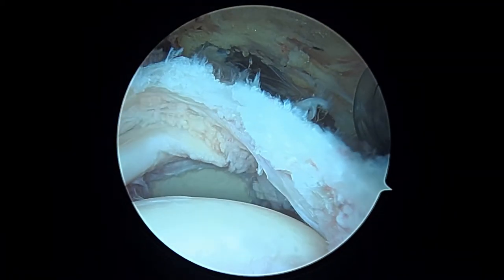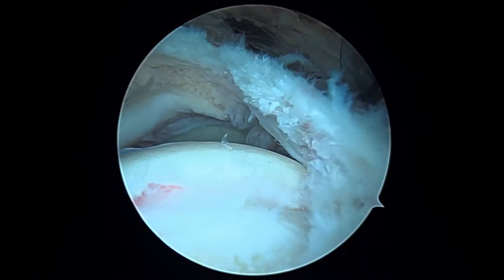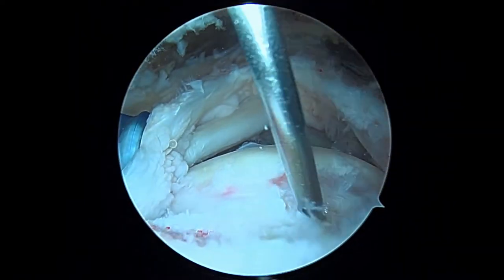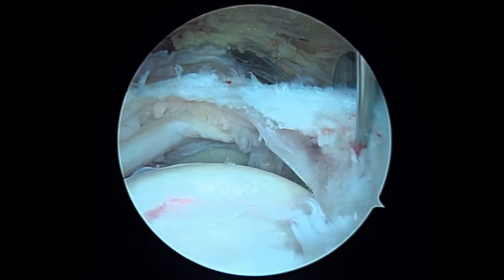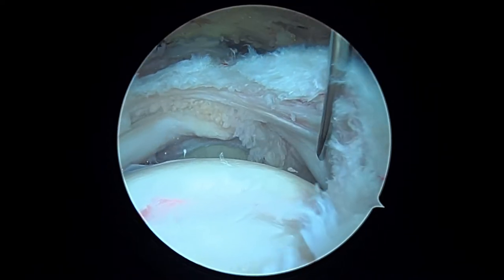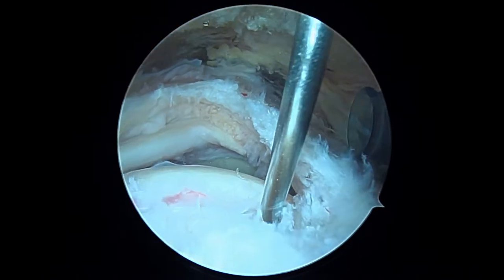The first step is to take a spinal needle and get a good angle to place our first suture anchor in. That looks like it'll be a pretty good angle — maybe if I move a little bit back. We can see how far back this tear goes and that it's delaminated. I want to get this deep layer incorporated into the repair, so we're going to place our first anchor right about here.